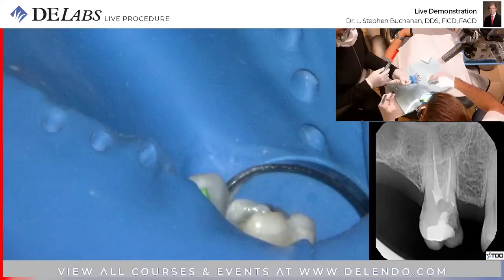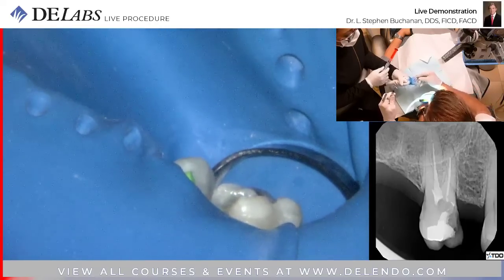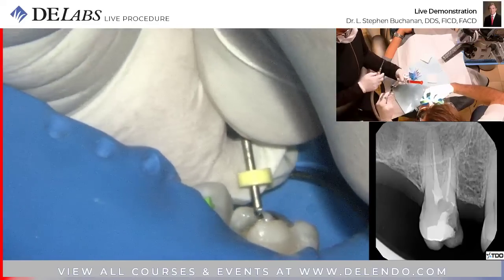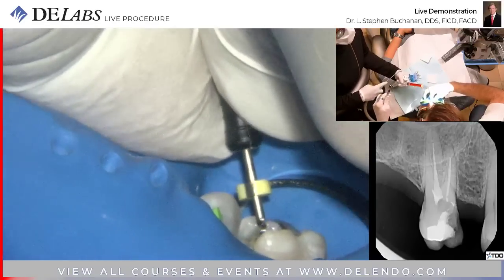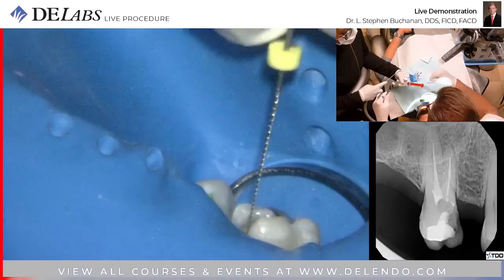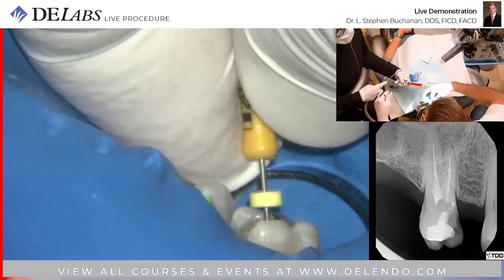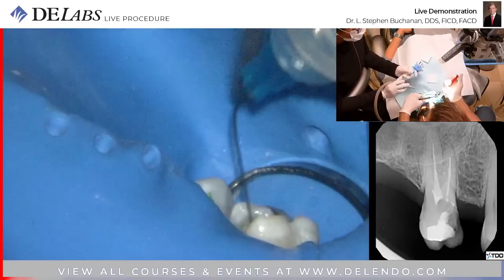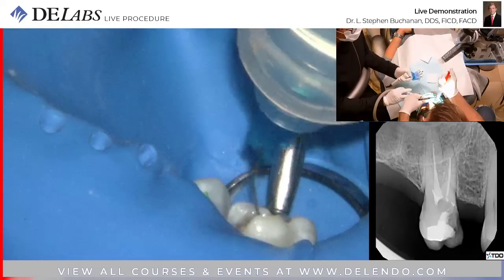At length, maybe slightly through. Here's the 40. I said there was about a 32, right? And the 40 is fitting almost the width of the stop, which is an 06 taper. Last act with the file, getting patent with the 20. That canal is done until it's cleaned and ready to fill. Done in instrumentation.